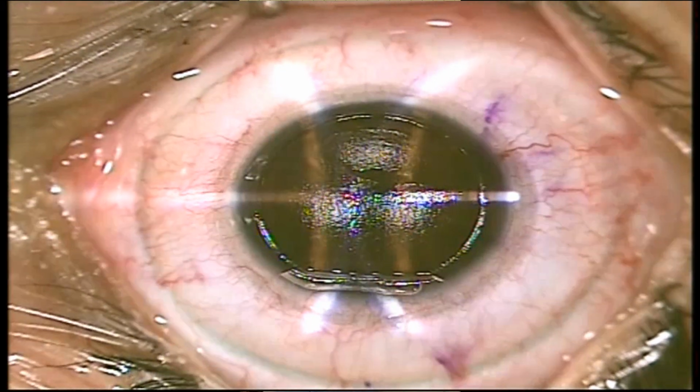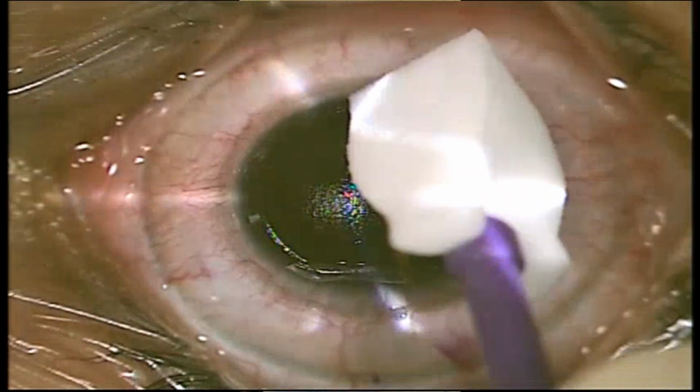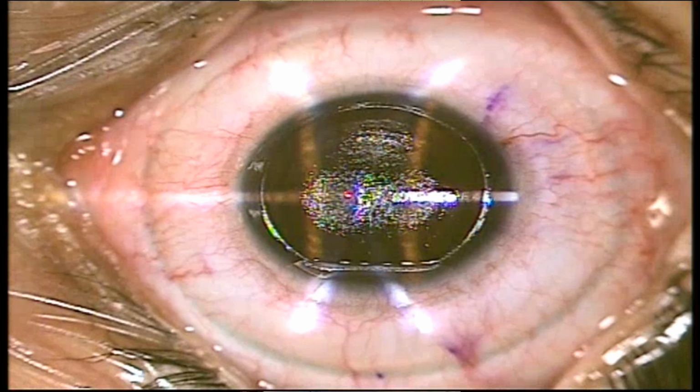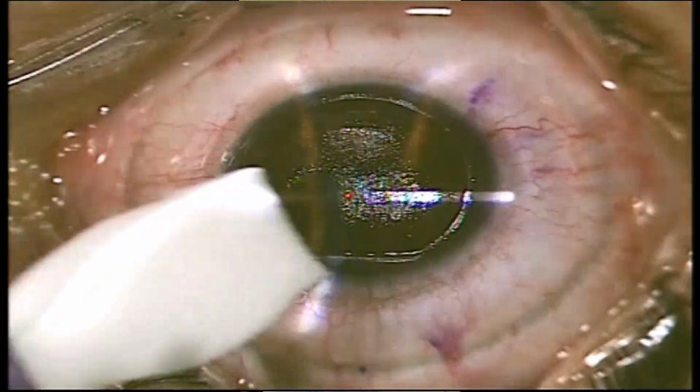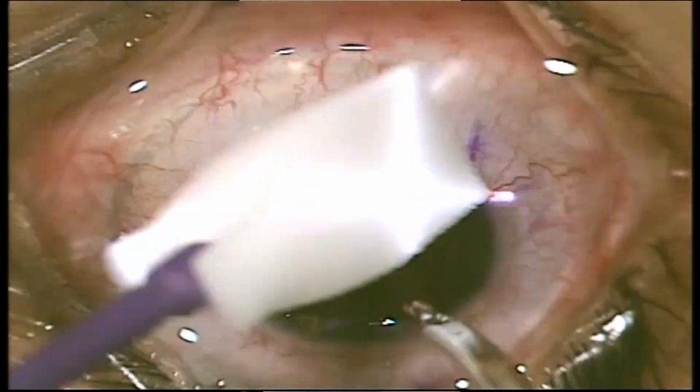Here you can see the laser. There are two convex half circles, so they need to be aligned one on one side of the other. Here you can see those two curved lines are aligned, and these are the red lines you see. This is the excimer laser being done, and once that's been finished, you move it. Here the laser is still being applied, so it's been completely done. That was after finishing the laser.